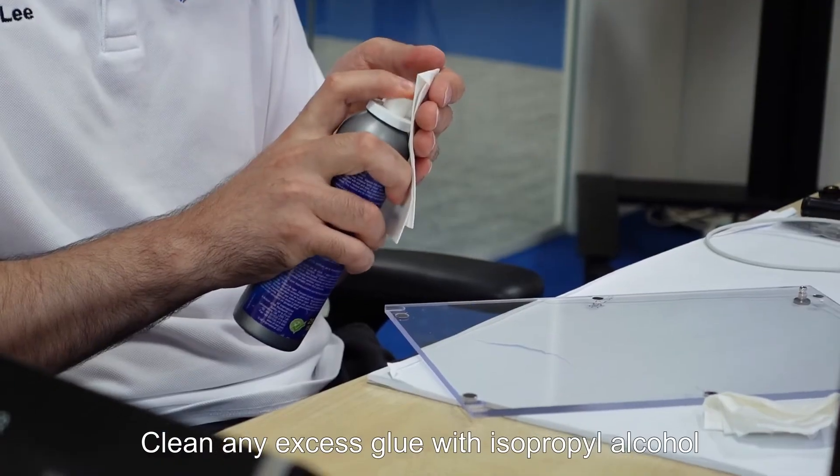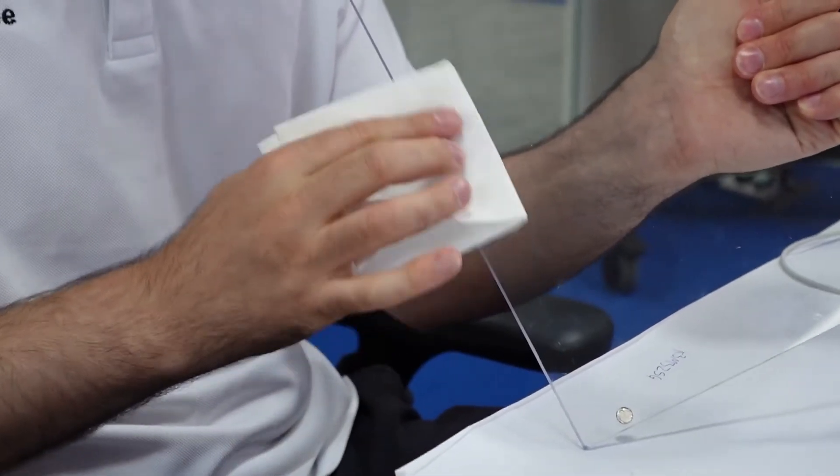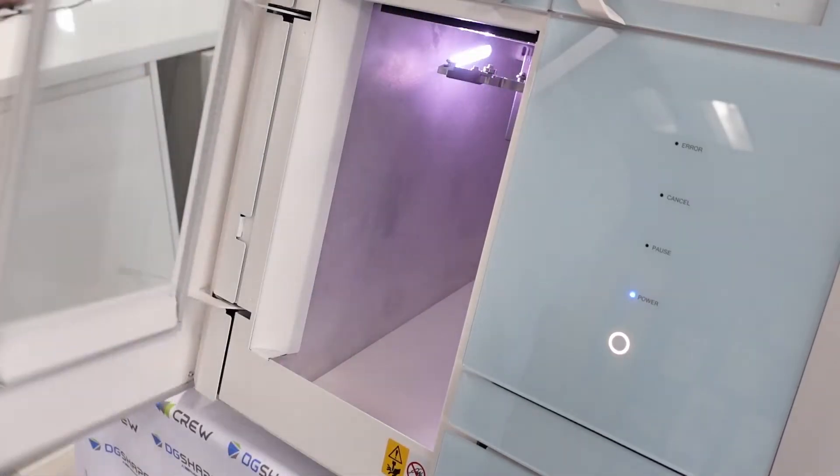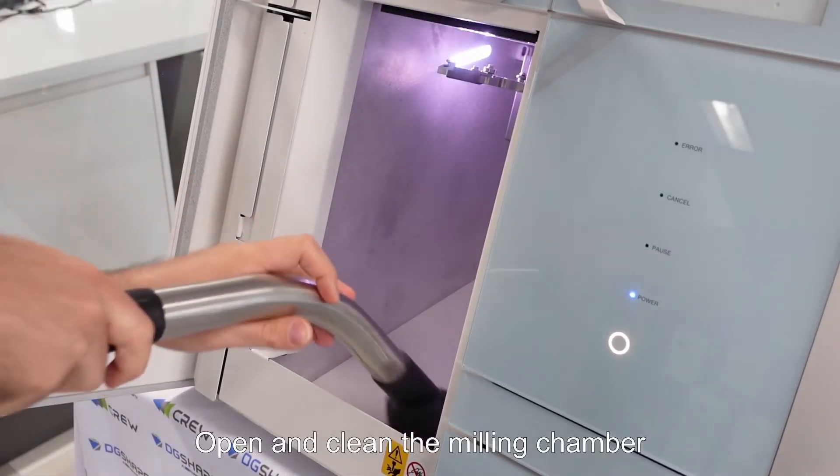Clean any excess glue with isopropyl alcohol. Open and clean the milling chamber.